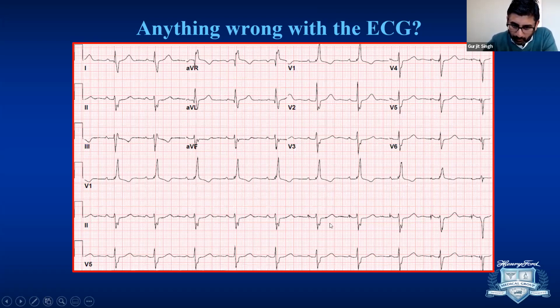So remember I talked before, if the pacing spike is happening after a signal has started, a QRS or a P wave, that usually means it is undersensing. It did not sense that signal and the pacing output has been released. So this is an example of atrial undersensing, which is transient. Okay, then let's look at the other ones.